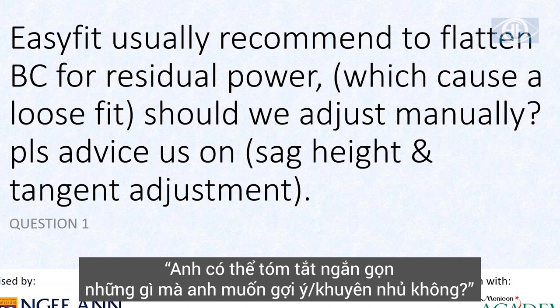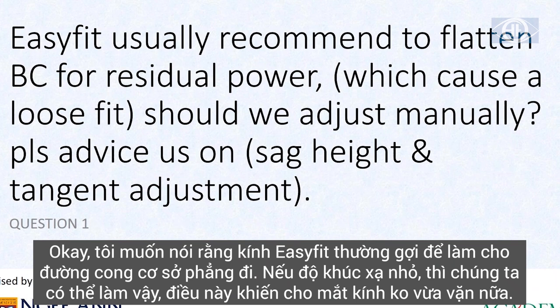Okay, well, let me say the question. Easy fit usually recommended to flatten the base curve. Depends on what? For residual power, yes. If the amount is small, we will do that, yeah. Which causes a loose fit? I don't agree. Why should we adjust manually?